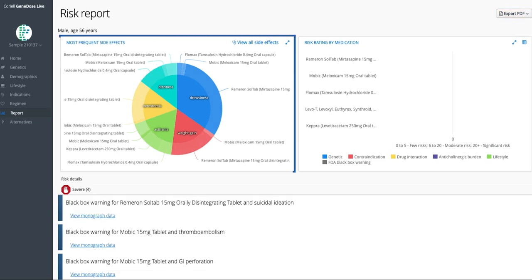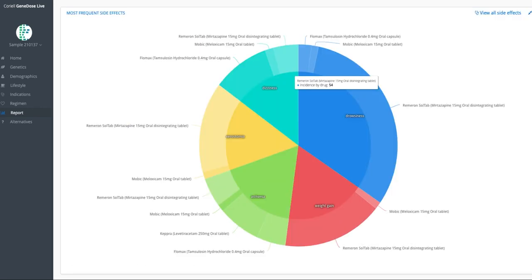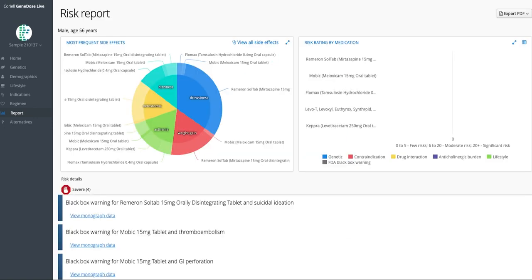On the left, you will find a box called Side Effects, each of which is given a score, and the responsible drugs are weighted. Once the scores are as best as they can be, this is worth reviewing and explaining to patients. The portal can be revisited as often as necessary and only by clinicians. The offering can be shared with as many different colleagues with the patient's consent. Following POPI Act protocol is of utmost importance.